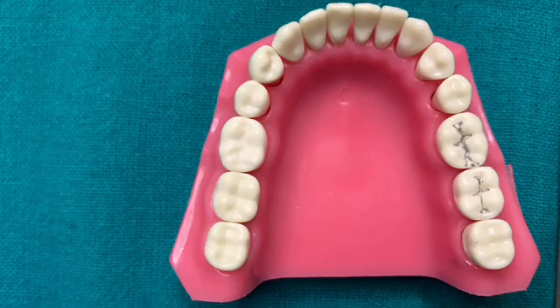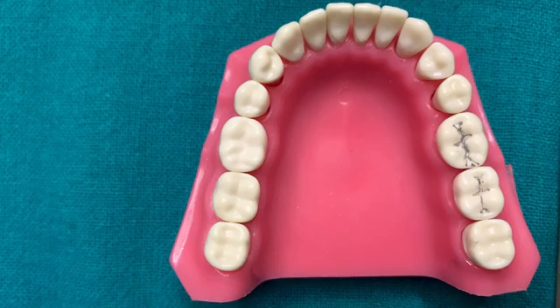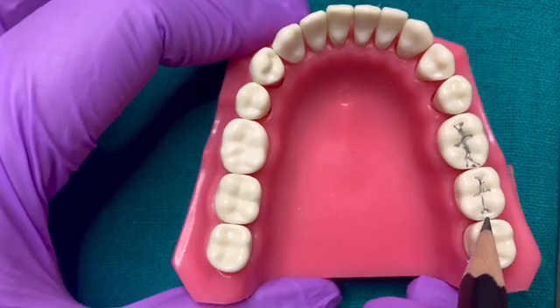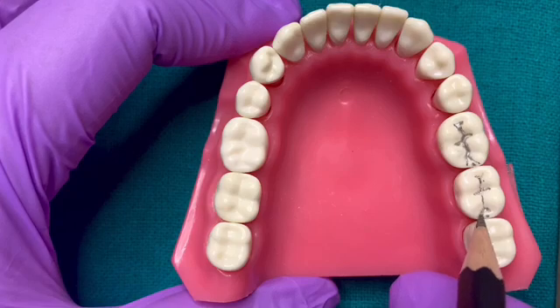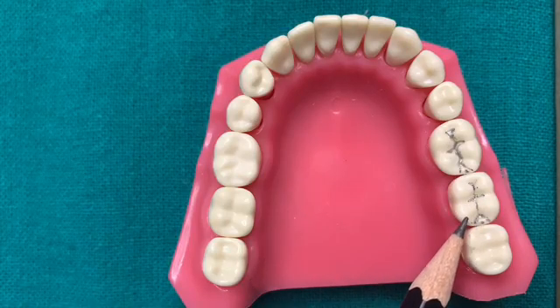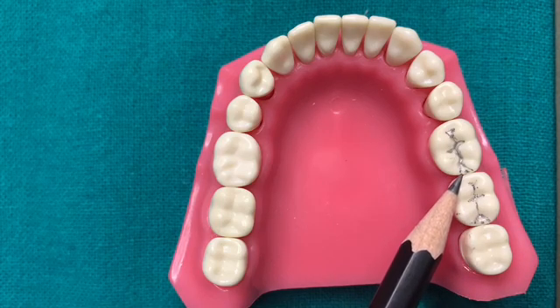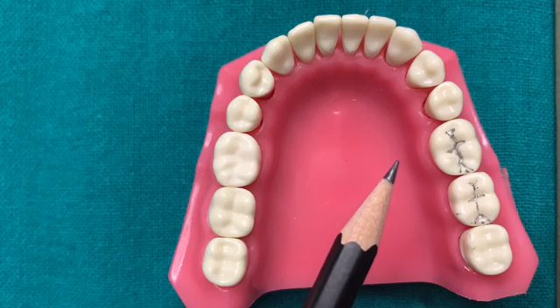At this point, I want to make one thing very clear. The outline form for the proximal box varies with the tooth anatomy, its location, and its contact with the adjacent tooth. If you observe the contact of the second molar with the third molar, the contact happens somewhere here, so the outline form is more centered as compared to the first molar, where the proximal box is more buccally placed. Keeping in mind the basic principles, you have to modify slightly depending upon the location of the contacts.